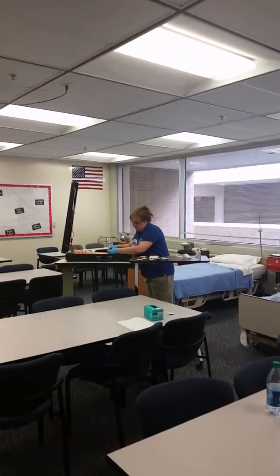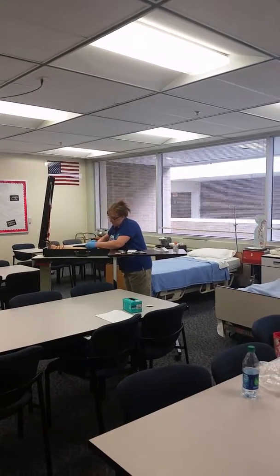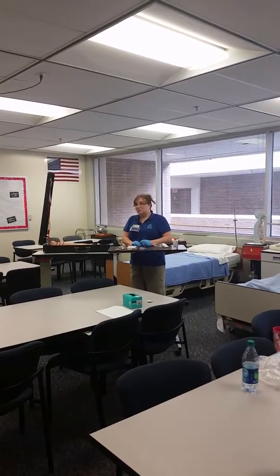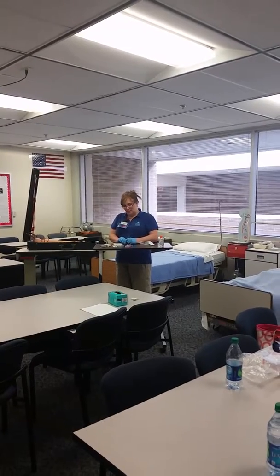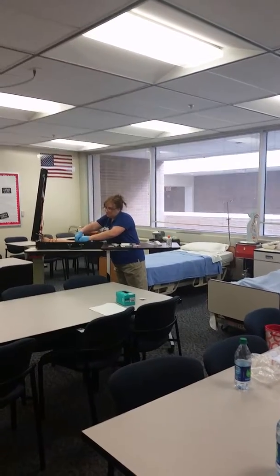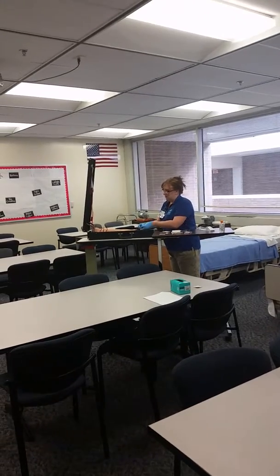I'm going to peel off the label. Okay. I'm going to document time, date, gauge, location, and my initials. Apply that where it doesn't interfere with the IV. Okay, then I'm going to tape my tubing.